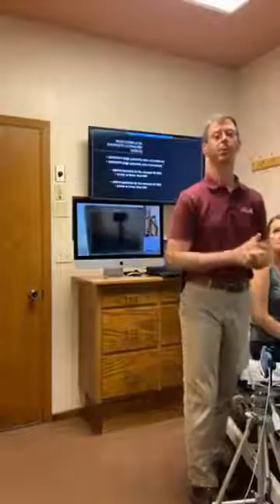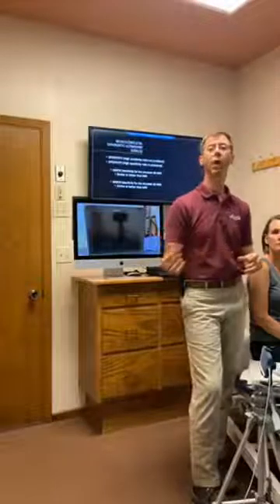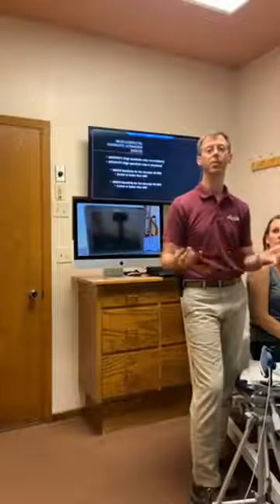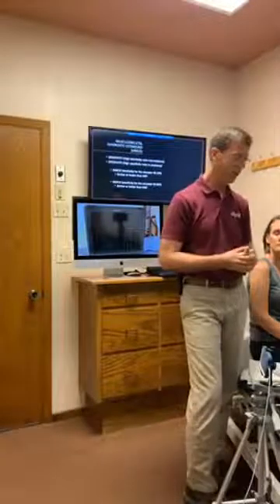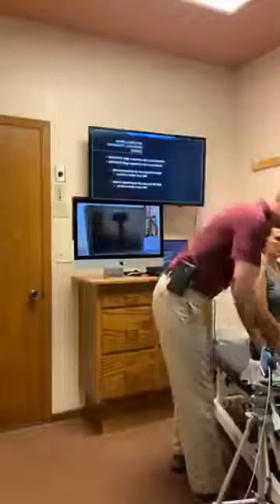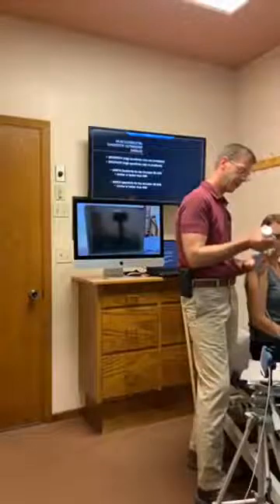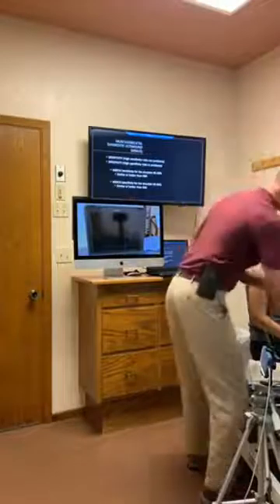It's a great tool, very inexpensive, that we can use in real time, as well as dynamic testing. Dynamic testing is the ability to look at some structures in real time while they're moving, which you cannot do with other diagnostic tools. So let's look at a structure right now. We're going to first look at the long head of the biceps tendon.